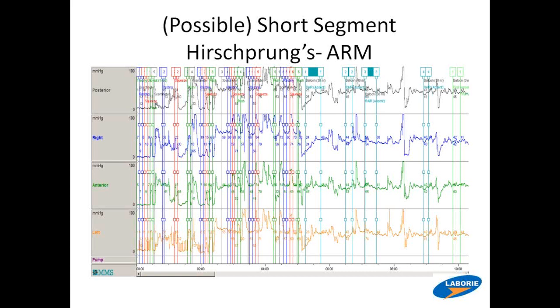The high average rest, I call it mean maximum rest, and her sphincter length was 3 centimeters. Again, pretty good, right? Here's the 3 centimeter marker, and you see that's where the baseline goes up. So mean maximum squeeze 71. It isn't great. You expect it to be closer to 100.